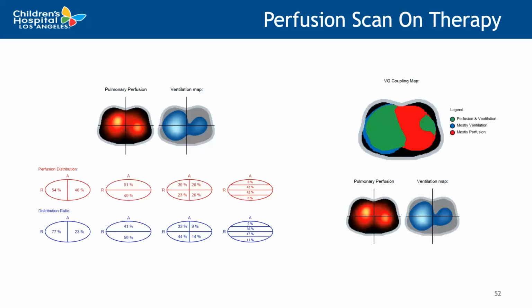The device itself is also able to produce an actual map, similar to the ones that I did earlier, but I would say a little bit higher quality. The perfusion map here shows that she had pretty homogeneous perfusion to both her right and left, and actually had improving perfusion in that area that I showed earlier.